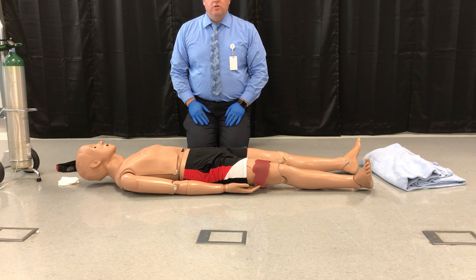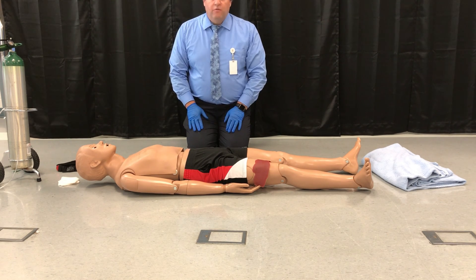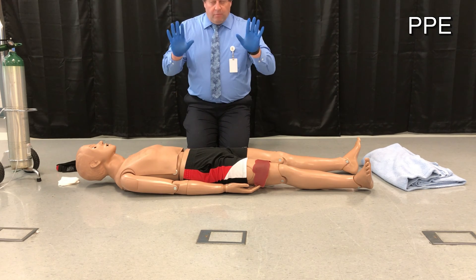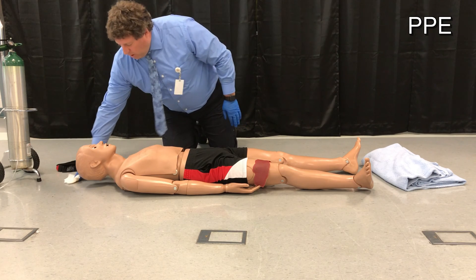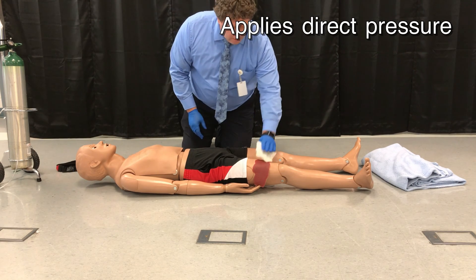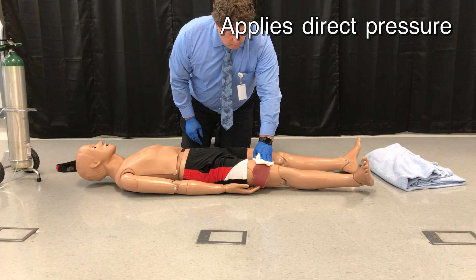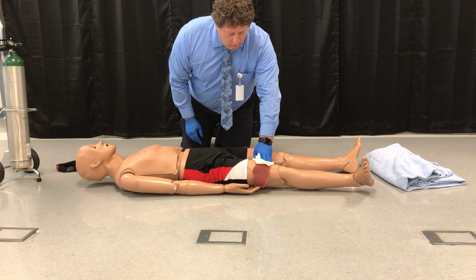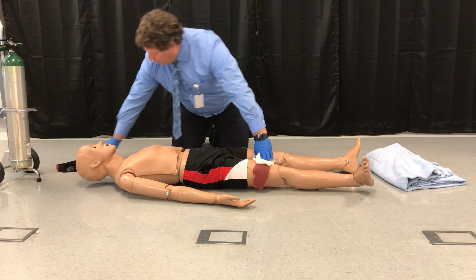Bleeding control and shock management. I have assessed my patient and found that he has a major bleed from his right thigh. I have my personal protective equipment for my crew and myself. I notice the bleeding, so I take a dressing and apply direct pressure. The wound is continuing to bleed, so I will need to apply a tourniquet.